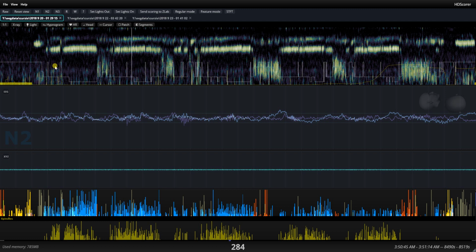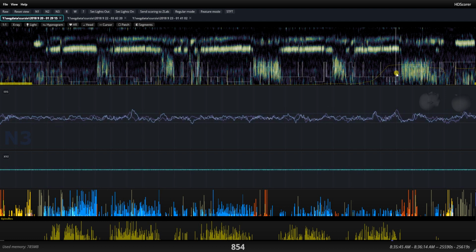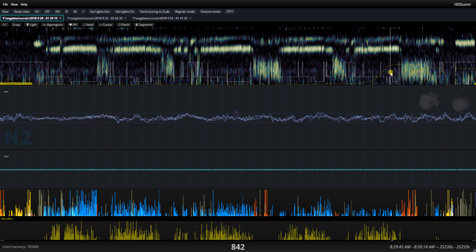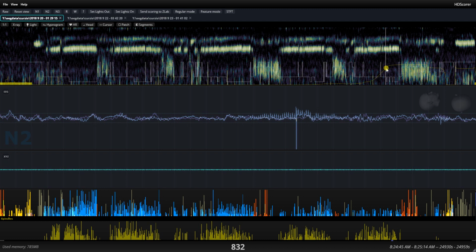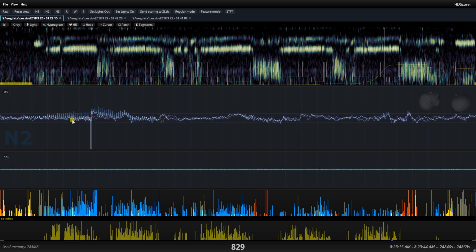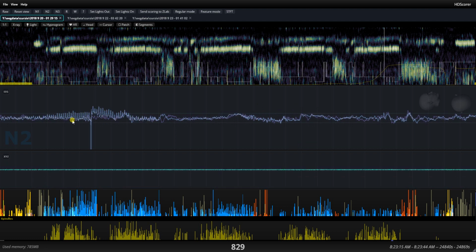The next thing I would like to do to wrap up this validation of N2 versus N3, let me try to be very precise here. Towards the end of the night, I was not expecting to see N3 sleep, so I would judge this small gap to be a little bit suspicious. Perhaps it picked up some sweating or something like that, so I would go to it and examine it and see, yeah, actually that does look like N3 compared to, for example, this, which is guaranteed to be N2. This is something that's for sure N2. Here we got some kind of artifact. To check out what that is, I turn the filtering on and off. You know what? I don't know what that is.